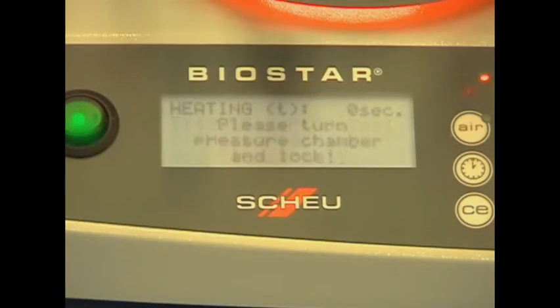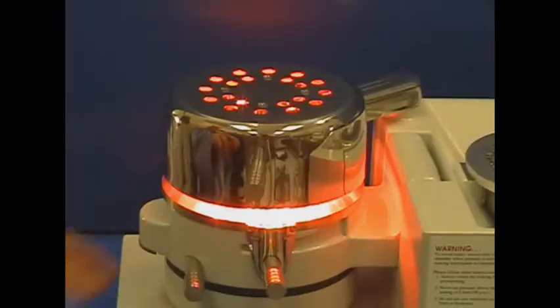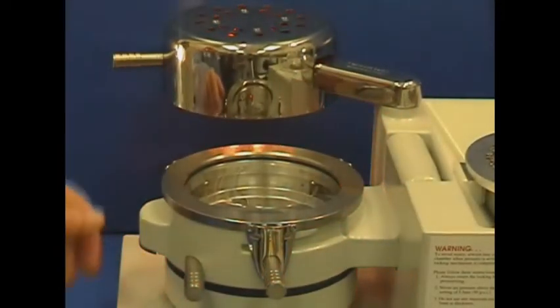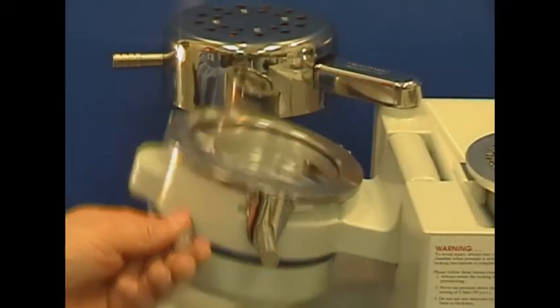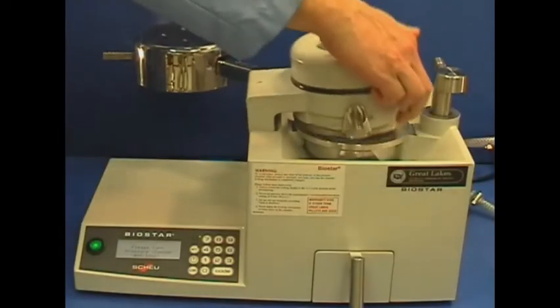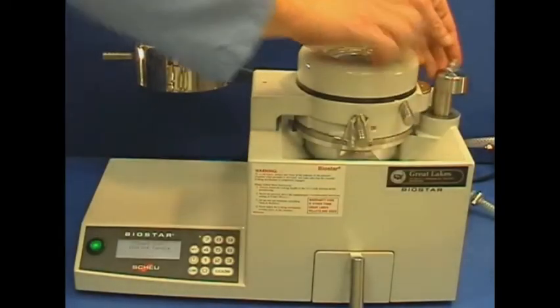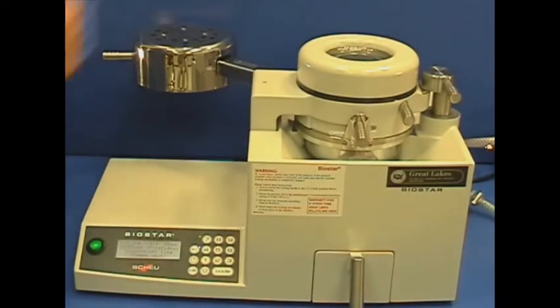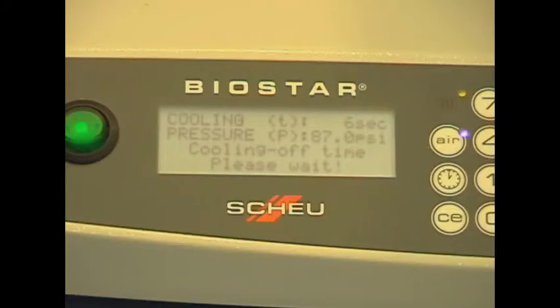At the end of the heating cycle, remove the lamp from the material. Swing the chamber over the model in the pellet cup and lock the chamber in place to start the forming and cooling cycle. The material should be cooled under pressure for 2 minutes.